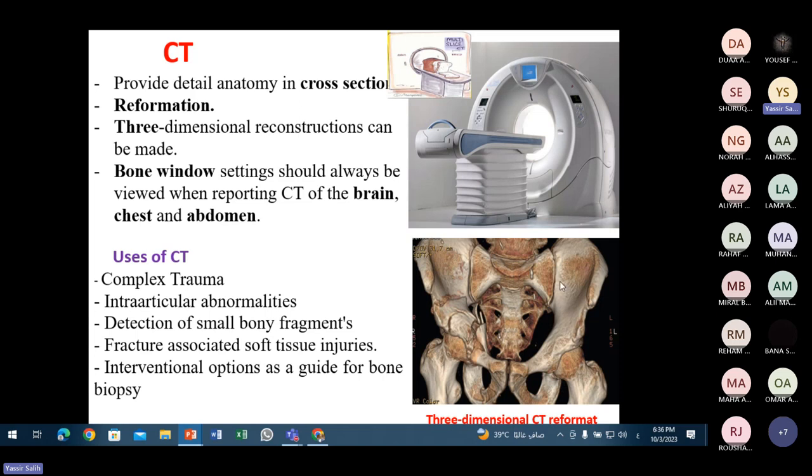If you look at the pelvis, it is not one unit. You can see, for example, the anterior spinous process, posterior spinous process, superior ramus and inferior ramus. But by plain X-ray, you can miss a fracture in, for example, the acetabular region.